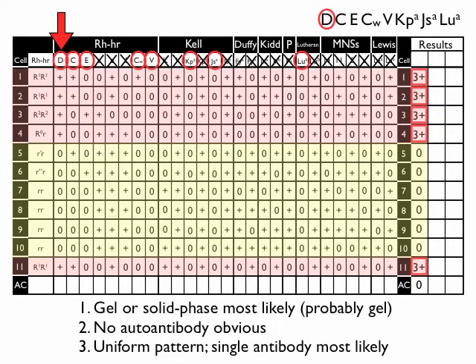Let's move on and look at anti-big C. Is that a possibility? So here's the C antigen, I should say. Let's look down the column and see where it's present on which cells. Well, it certainly wouldn't work as a sole antibody, would it? Because it doesn't explain the positive reactions in cell 3 and 4. It's odd that there's no reaction in cell 5 when big C is present. You could make the argument that it is a single dose big C, and you'd be correct because there's a little c there as well in cell 5. But it certainly wouldn't work as a single specificity. So what I would do is at least preliminarily say it's probably not big C by itself.